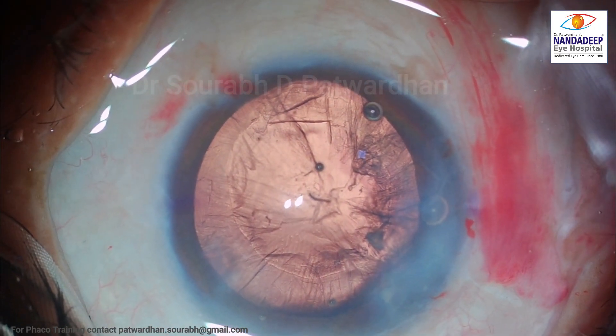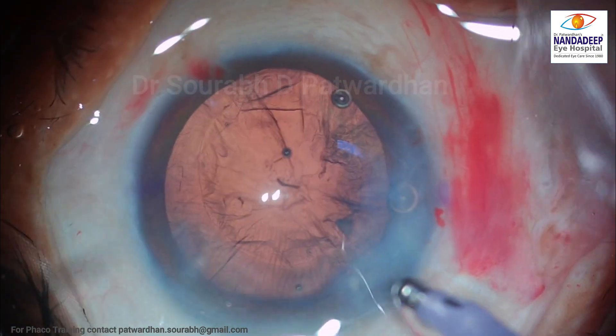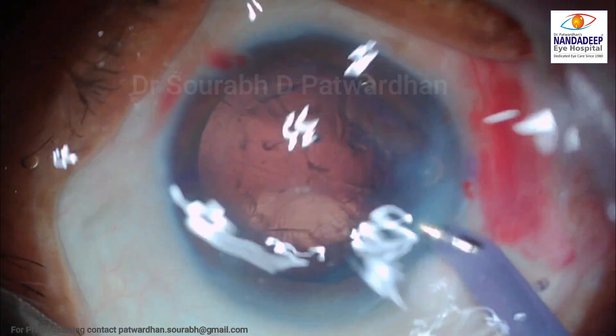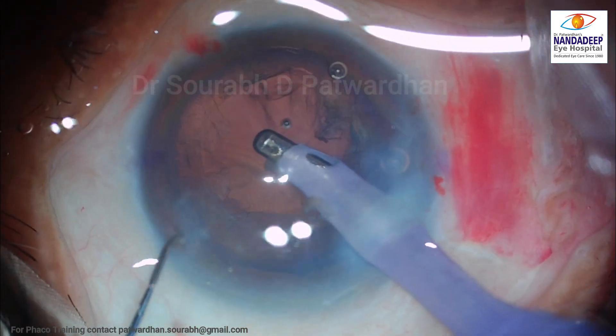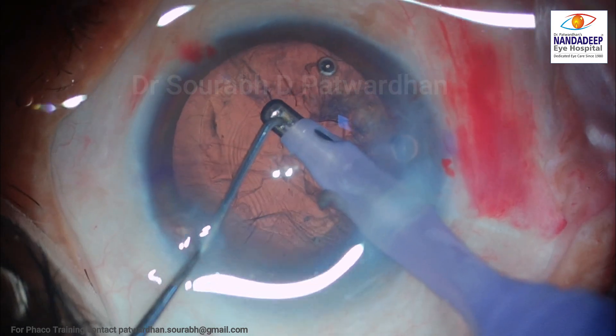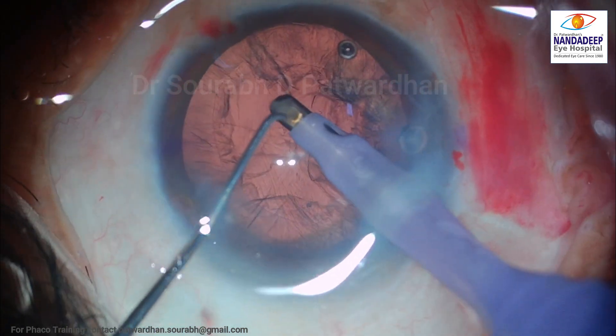This was a case of hard cataract and already pterygium surgery has been done. You can see there is an opacity on the nasal side there. And I am going to do a cortex removal step here using the coaxial IA.